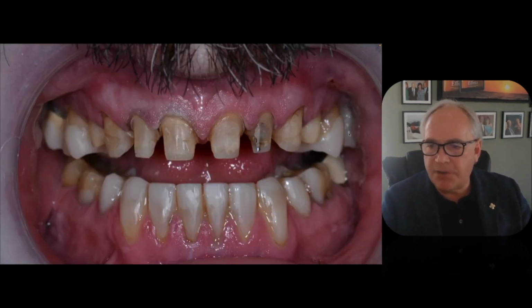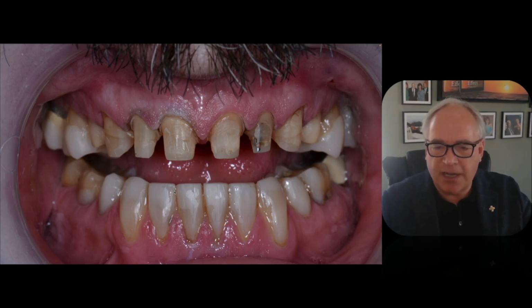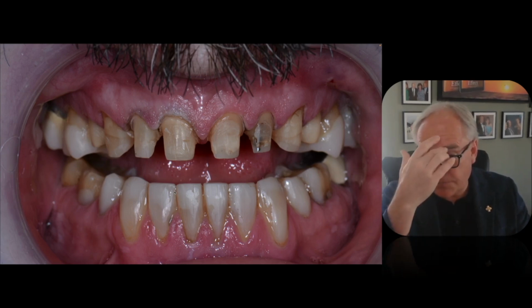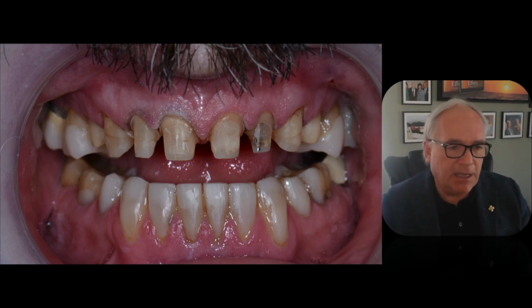So you can see the bonded toppers in the back. You can see where I've just freehanded some of the bonding and the potholes. And then this is injection molded. So what do I mean by that? We basically just make a silicone index from our wax up, the digital design we did, that comes in from the lingual. And we can tie off adjacent teeth with plumber's tape, but we can inject the resin into that matrix up to the height. I still have to do some freehanding on the facial, and I've got some work to do here. It's not polished yet, but I'm just getting that plane that we visualize digitally in the mouth. And you guys have probably done something similar to that from analog type wax ups.